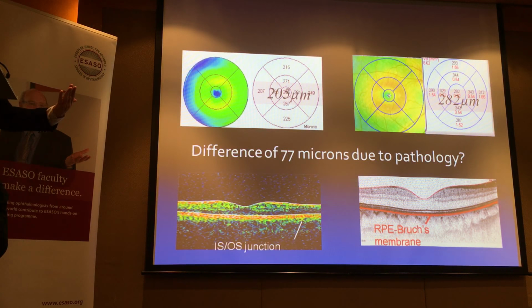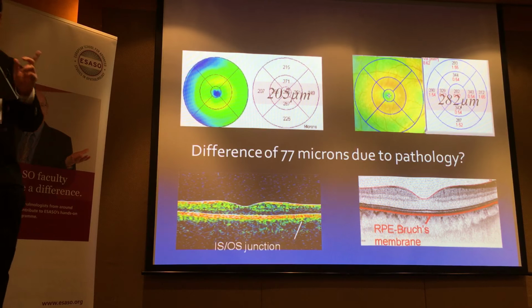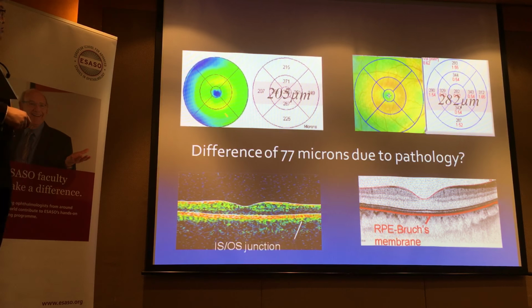Patient goes from one institution to another, comes to you for second opinion, you having a time domain, or just a different machine. It doesn't only mean time domain versus spectral domain. Right? So even say a Cirrus and a Spectralis and a TopCon have different measurements on retinal thickness. You can't entirely compare them. Right? So that's a very important thing. So again, if we don't realize this and you just go with numbers, that's how you can sort of get caught up.